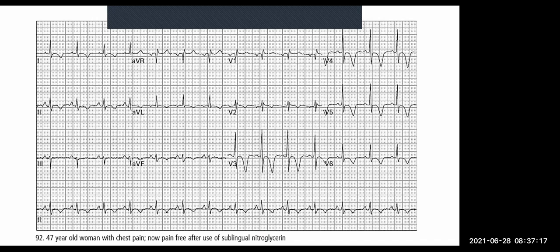So if your enzymes come back as normal, are you still sending her home with Panado, Tramadol, and TNT PRN? I wouldn't. There's something going on here. Agreed? Okay. So even though you're not 100% sure of what's going on here, something is going on. So there's a few ways that you could look at this, for example, from things that we've spoken about before.